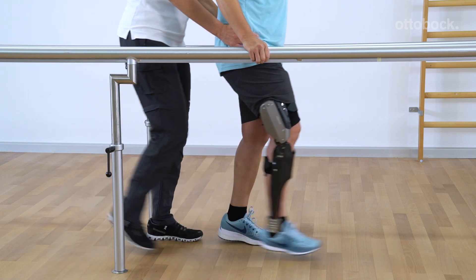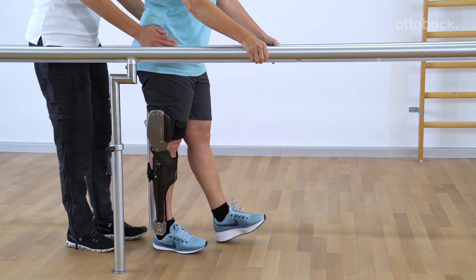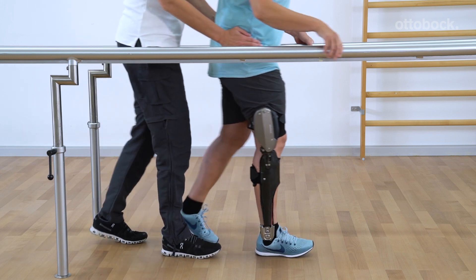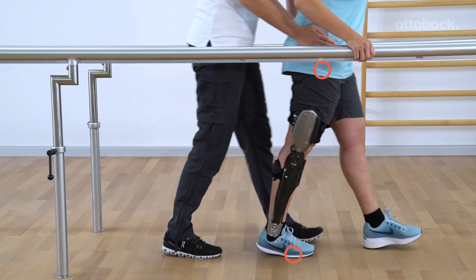Once the motion sequence can be performed smoothly, the patient can practice walking between parallel bars. The physiotherapist can support the patient's pelvis. Now the patient learns to shift their center of gravity forward over the leg with the orthosis.